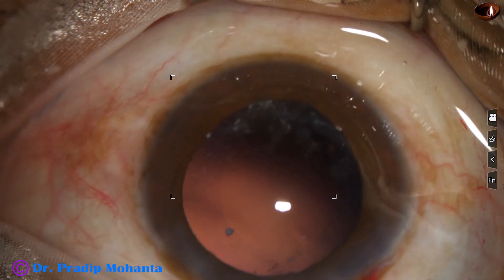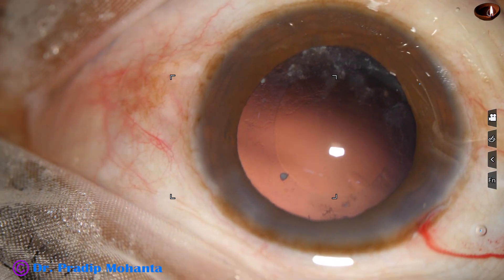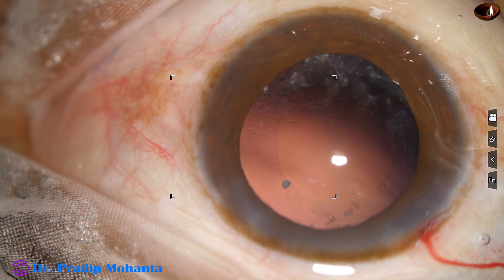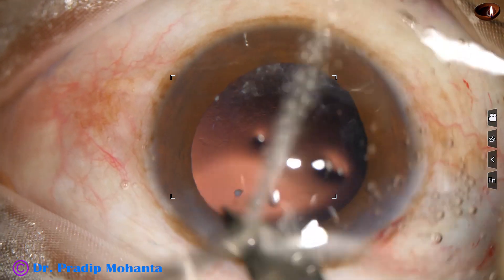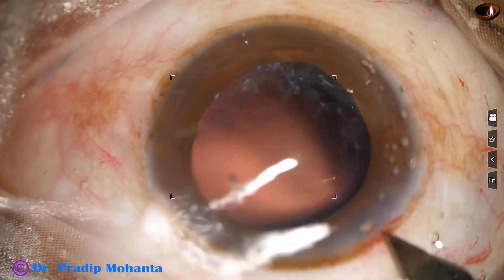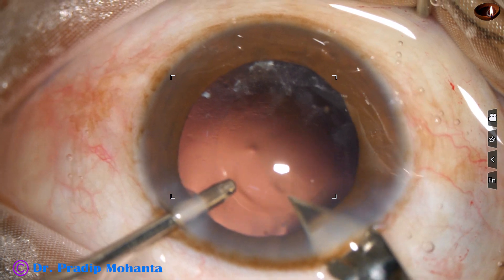This is a totally unedited real-time surgery. We are now going to implant the intraocular lens. This is a hydrophilic acrylic single-piece monofocal intraocular lens. The cartridge is a little wide, so I am going to enlarge the main wound a little bit.